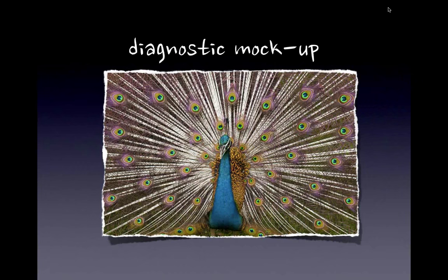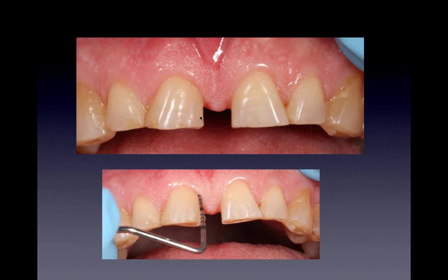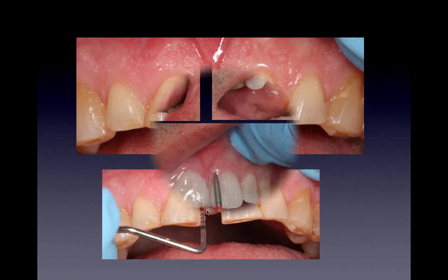Diagnostic mock-up. I love the flowable composites. For me, this is just really quick. The first thing I'm going to do is analyze the color. He's an A2. He wants super white teeth. He's a businessman. He's worn his teeth down. I do some probing. What am I probing for? If I'm probing 3 millimeters, I can do laser surgery too. If I'm probing 1 millimeter, then I need crown lengthening. So I do a quick probe. You see here, I'm 3 millimeters down. I can do any kind of recontouring of his tissue. But I'm just trying to do a mock-up, so I just need to know what I can get away with.